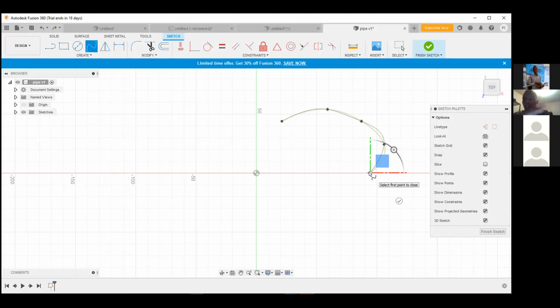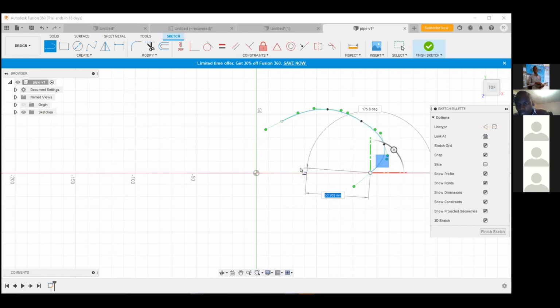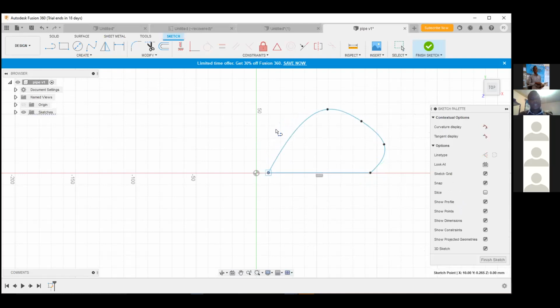Then draw a straight line. Where you are doing it should be a straight line. It has to be a straight line so that it becomes an axis. And it has to be continuous. You need to go fast and draw a line. You're supposed to draw a line. Yes, now draw a straight line to join whatever line you are doing. Draw a straight line. Okay, yes. Good. Then use that profile, finish sketch.